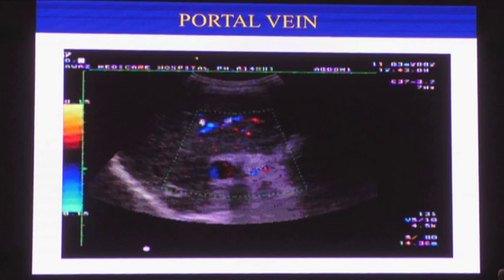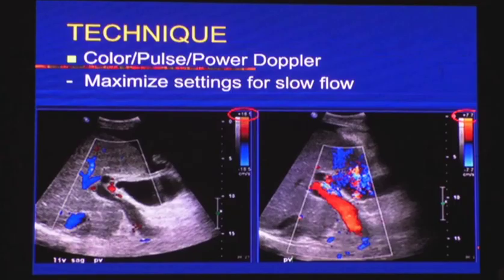When there is sinusoidal damage in chronic liver disease, there is reversal of flow. You can see red and blue mixed — that is due to sinusoidal damage and forward flow is not maintained. Technique is very important: if settings are not set properly, you might not see any flow. If the velocity parameter is set too high or too low, you won't be able to see the flow and may erroneously diagnose portal vein thrombosis when it's not actually present.